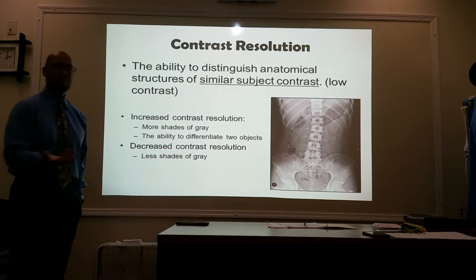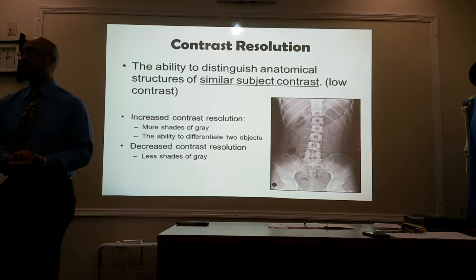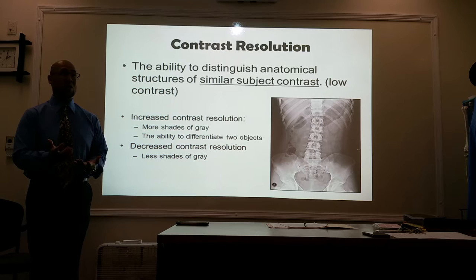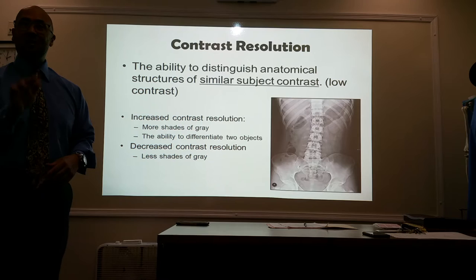Okay? Now let's break this down a little bit more. In describing contrast resolution, if you have increased contrast resolution, that means that there are more shades of gray. Don't get this confused with high radiographic contrast, because when we say high contrast, we're saying it's black and white, right? When we're talking about contrast resolution, if you have high contrast resolution, that means there are more shades of gray. We are able to delineate the very similar structures.